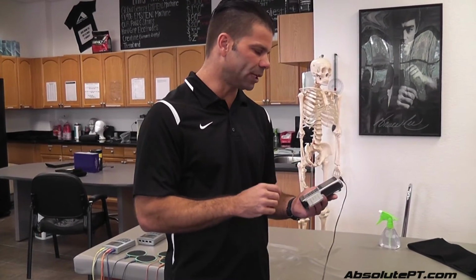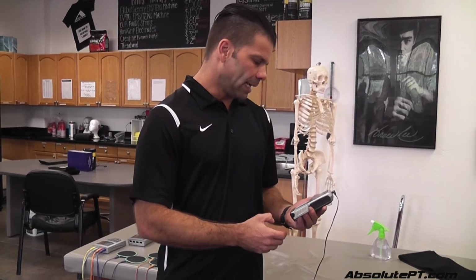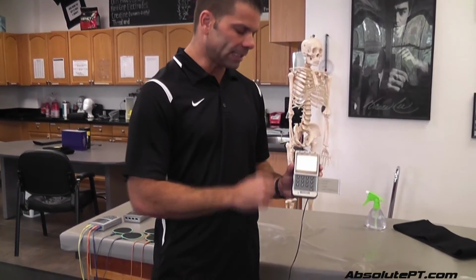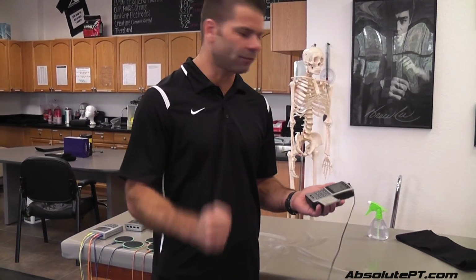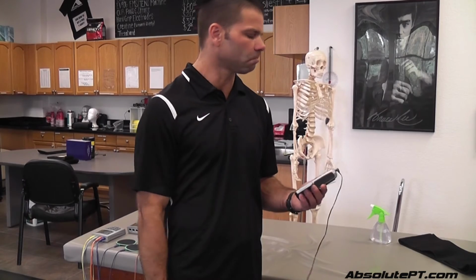But if someone has weak muscles on their calves, then stim is great. In my case, my calves are not weak enough that I'd rather just work out. But thighs, stim works great. Abs, it's better than anything, better than any exercise in my opinion. And so I'm resting for 50 seconds, which gives me a good amount of rest so that when it hits, it's going to hit hard.